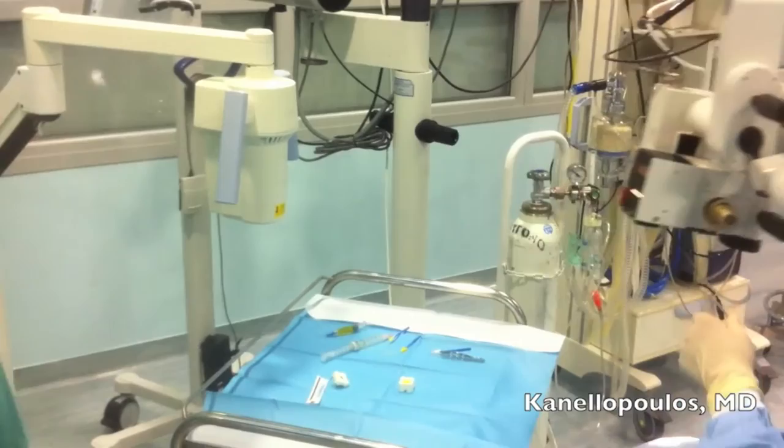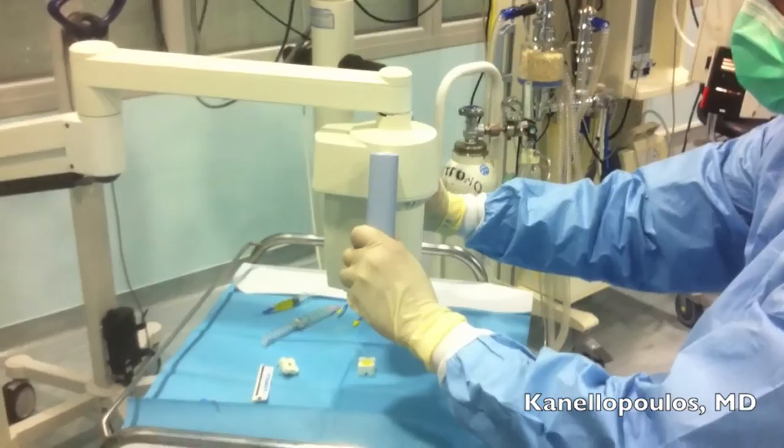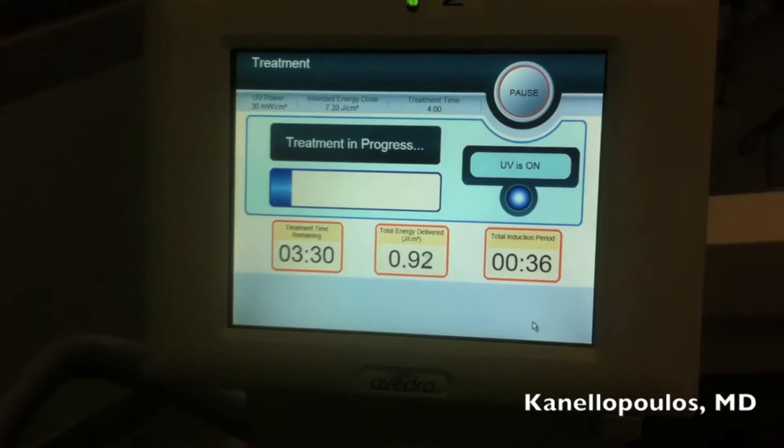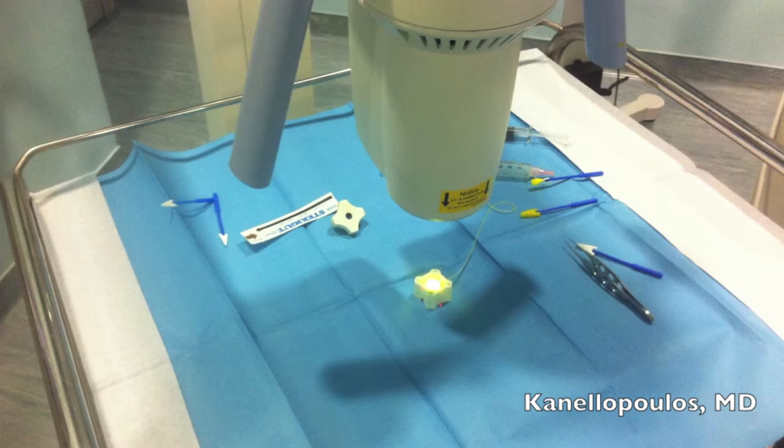This is the residual cornea that we did not use. We're soaking it with riboflavin 0.1%, as you can see, placed upside down. Following soaking, we used the KXL1 device by Avedro to treat with 30 milliwatts per centimeter squared for a total of 4 minutes and 7.2 joules of energy. After this treatment, moxifloxacin antibiotic was applied.